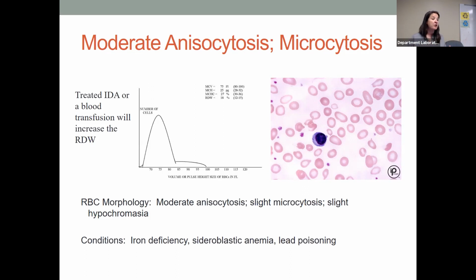All right, so when you're grading your red cell morphology, you want to take the predominant cell population, and then you will note what else is present. I think that causes some confusion for a lot of students because they want to notate everything. Like, well, so I have some normal size cells, I have some smaller cells. Okay, but you're going to pick the predominant size, and then you're going to note what else you see. All right, so if you have majority normal, but some small, you would say normochromic, normocytic with the presence of slight anisocytosis. Okay, does that make sense to everybody? That's where some of this red cell morphology grading is very subjective.